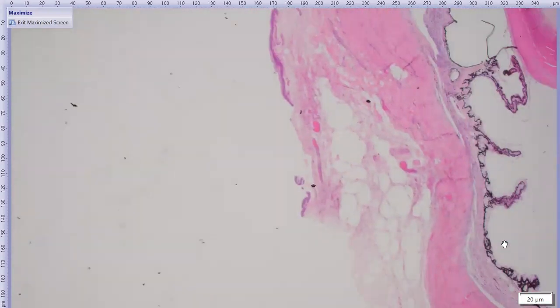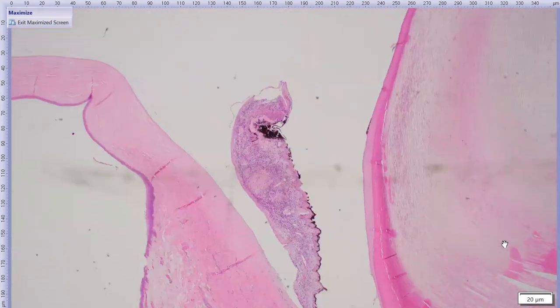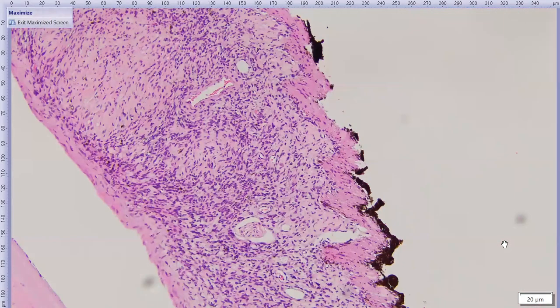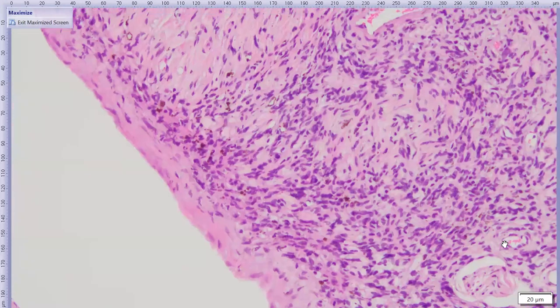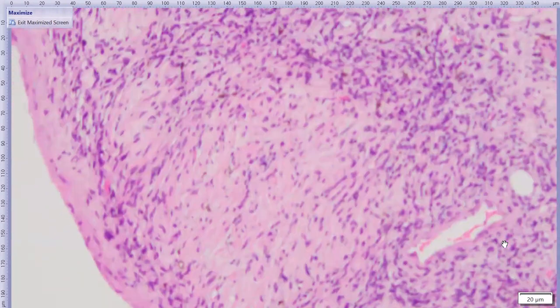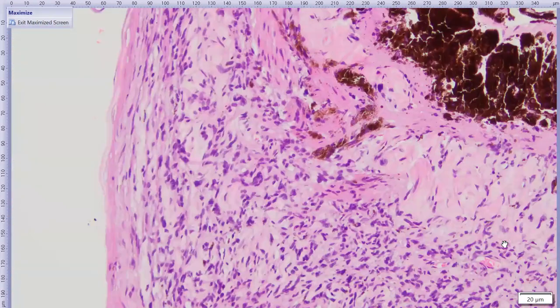So, not an uncommon situation. This was described as an inflammatory reaction, but once we get a little closer, you realize that this iris leaflet is too hypercellular, and it's not an inflammatory hypercellularity. These are neoplastic cells, and they're fusiform, and they're going here, there, and everywhere. They're forming pretty distinct whorls and some streams, and there is a neuropil-looking background throughout this mass.